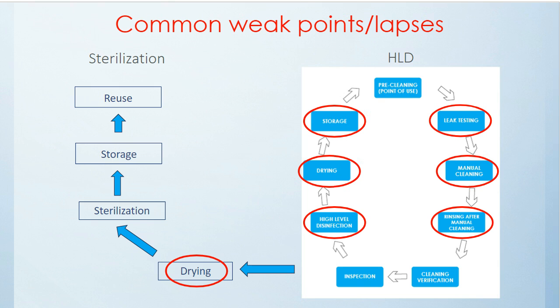For leak testing, we've now recommended that you verify that your leak tester is working properly, because we've seen many instances where even though the leak tester is putting out the proper sound, or it sounds like it's working, it's either not putting out the right amount of pressure or no pressure at all. So that's why we've added in the verification of that step daily. Every time that it's used, it takes 30 seconds maybe to verify that your leak tester is working properly. We have breakdowns that occur, especially with manual high-level disinfection, why we now recommend the automated.